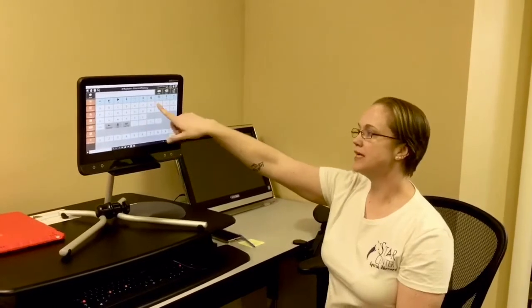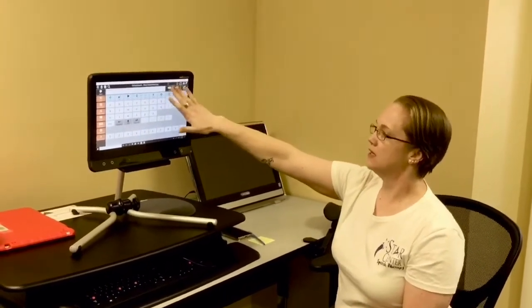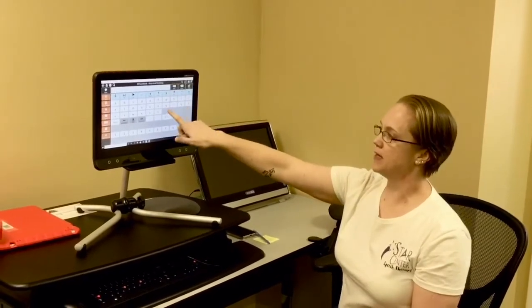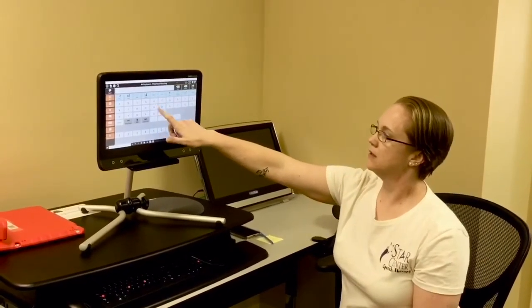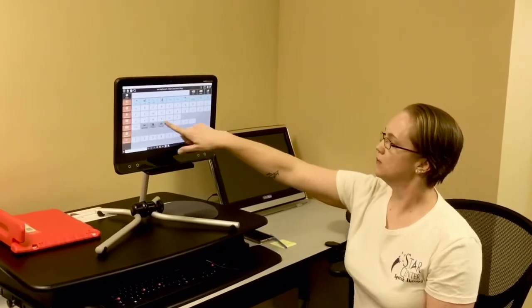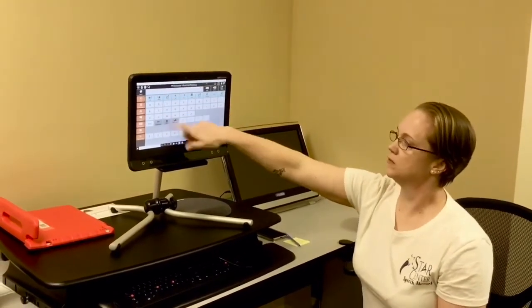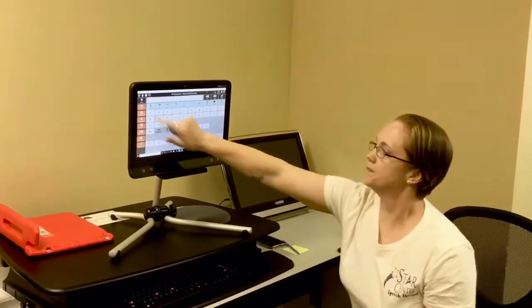This keyboard is set up to do word prediction. So even though I had I want, we could have started typing. H. E. L. And so your words will keep building. Help. Help is what I was looking for.